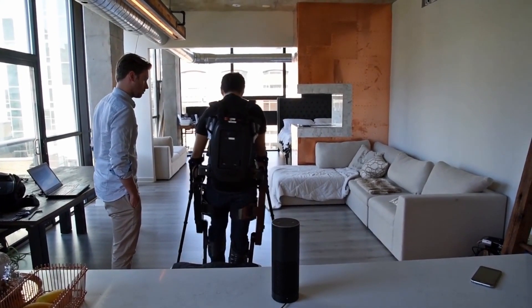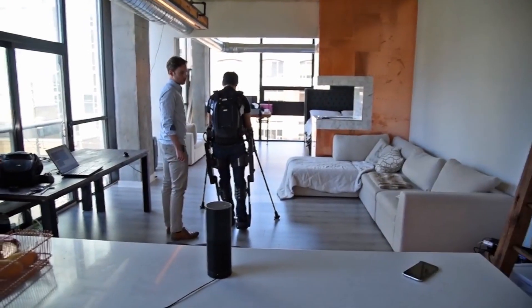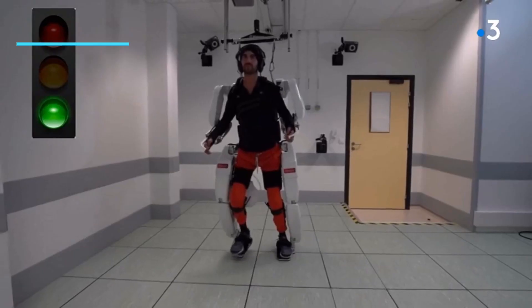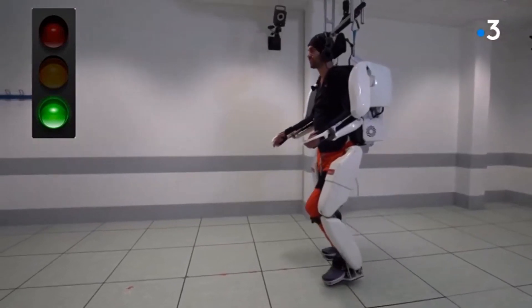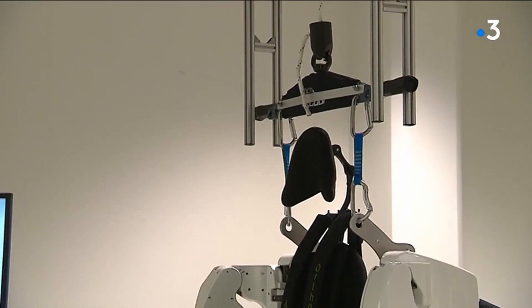Voice recognition seems amazing, but it's still a developing field. Even people who work on speech-to-text apps admit there is still a gap between machine understanding and human understanding. To bridge this gap between human intention and machine motion, we could literally transform thoughts into motion — brain-computer interfaces. If we can get the brain signals associated with a specific action and transduce them into commands for the motors, we can make people control an exoskeleton just with their brains.